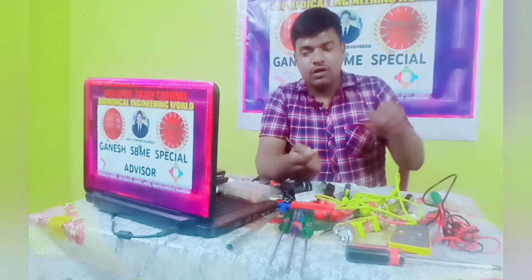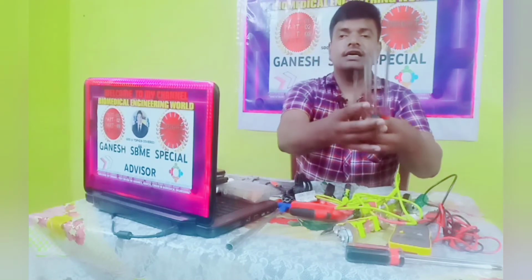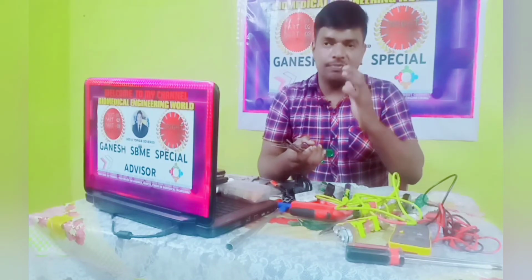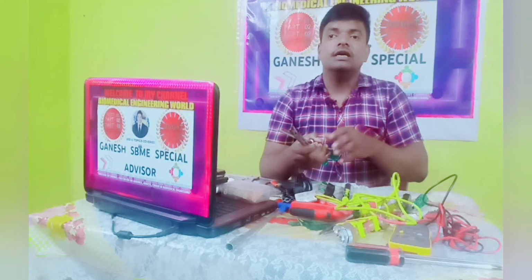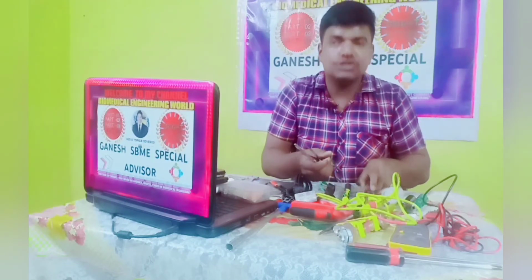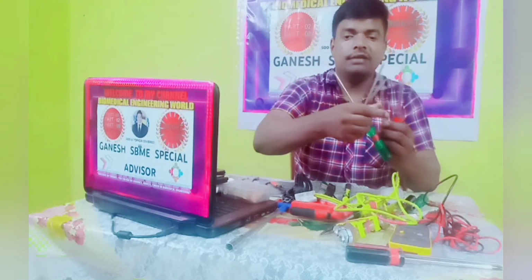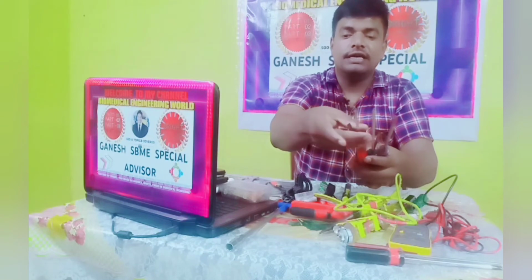Next one, screwdriver set. See friends, these are the screwdriver sets. Why should we have them? Because every medical equipment, every electrical, electronic medical device has all its parts assembled by attaching screws. So we should open the screws and fix them, because the screws are star, minus, long star, medium star, and minus. Different sizes are available, and all have different functions.